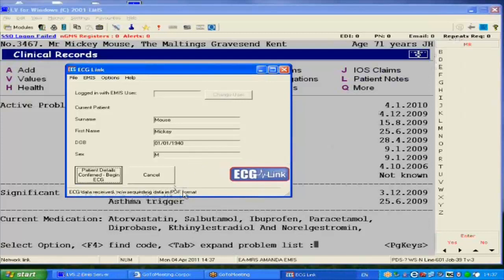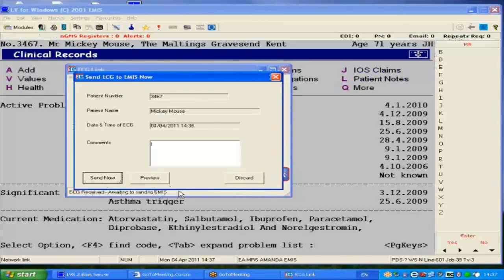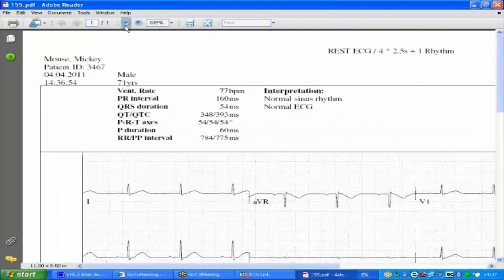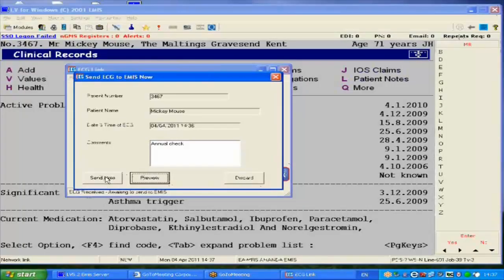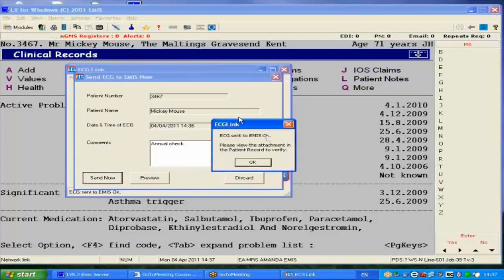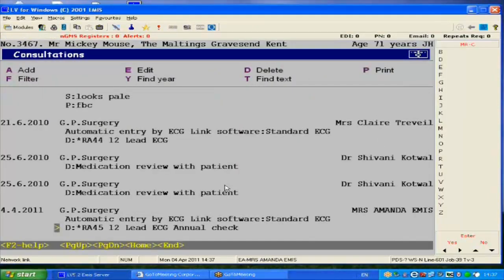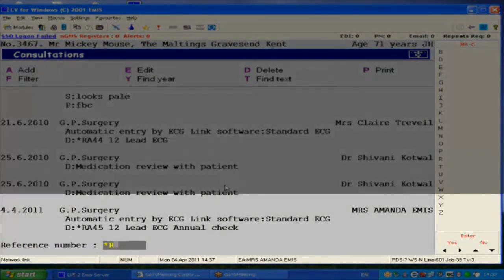Free text can then be typed into the comments box. The ECG can be reviewed, and once seen, we can press the Send Now button. Once attached, a prompt tells us the ECG has been sent to EMIS. This ECG can be found in the consultation as a star reference attachment, read coded as a standard ECG. To view, simply type in the appropriate star reference.